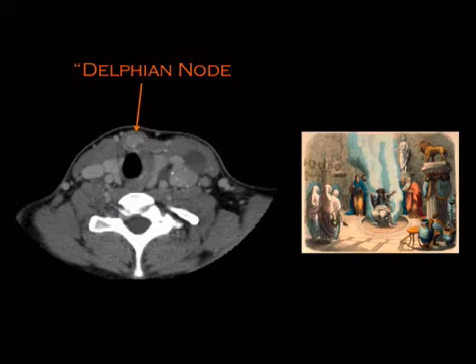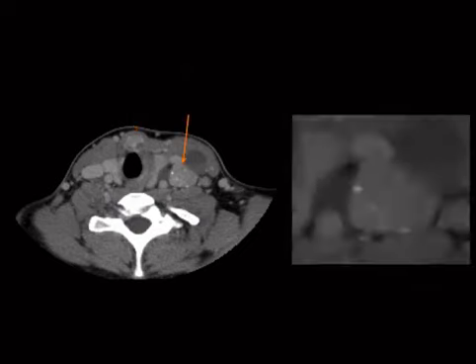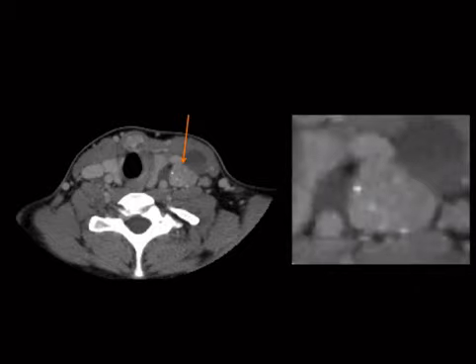And in this one, you would actually probably lead with thyroid cancer, and here's why. Notice that there are microcalcifications within these lymph nodes. This is classic papillary thyroid cancer. Papillary is popular, microcalcifications. This is a classic look for metastatic papillary thyroid cancer.